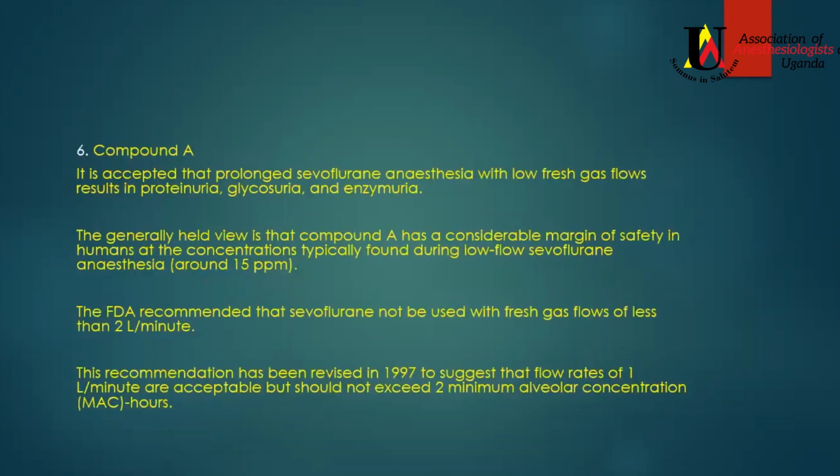You mentioned compound A. Some people have a fear that when you use prolonged sevoflurane, you can have a risk of this. However, this has not been shown to be associated with any clinical manifestation, even when such techniques are applied to patients with pre-existing biochemical renal abnormalities.